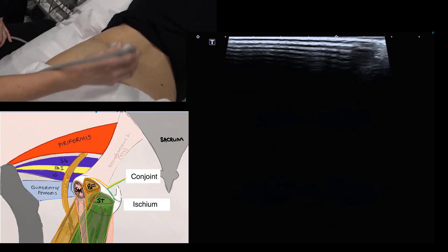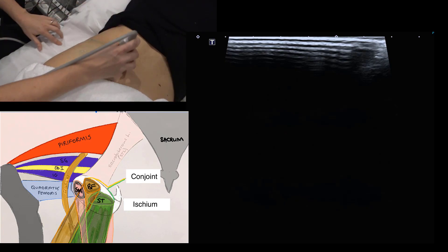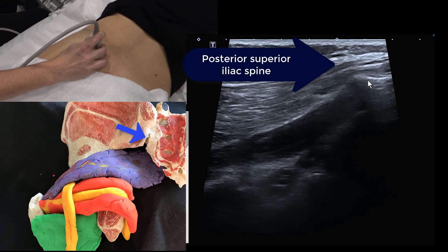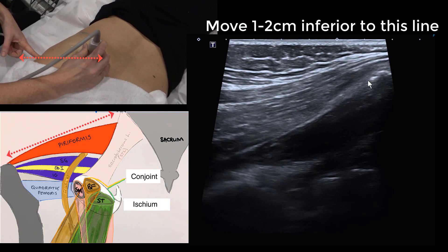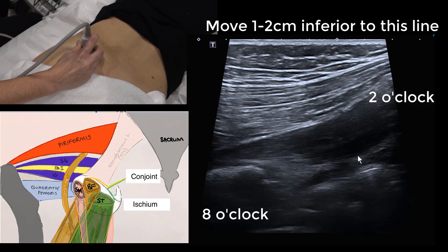To find the piriformis, we start near the dimple and move down to the posterior iliac spine — that little bony lump — and then draw a line from there to the greater trochanter. Angle the probe from 2 o'clock to 8 o'clock and you can see the piriformis muscle deep to the gluteus maximus.